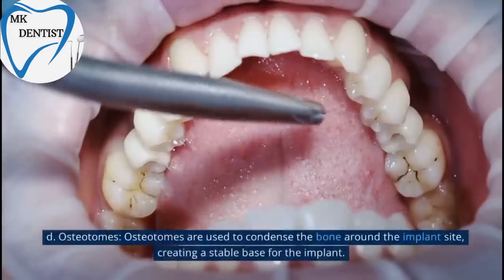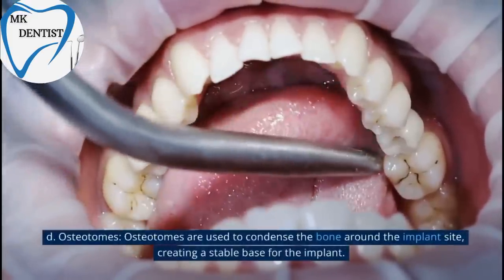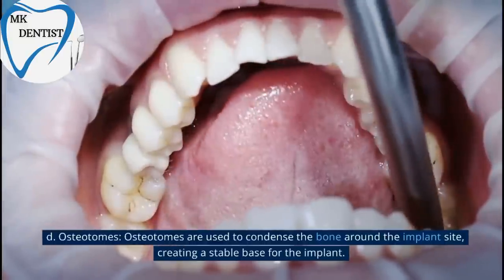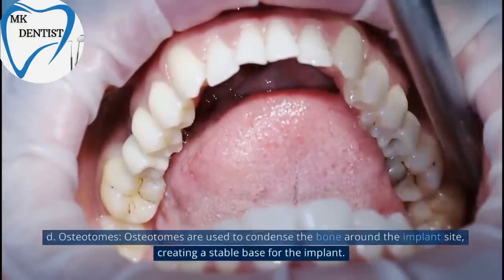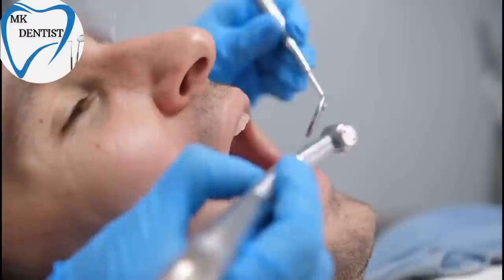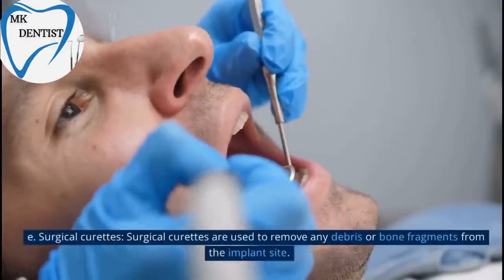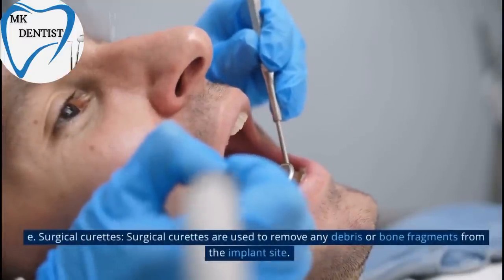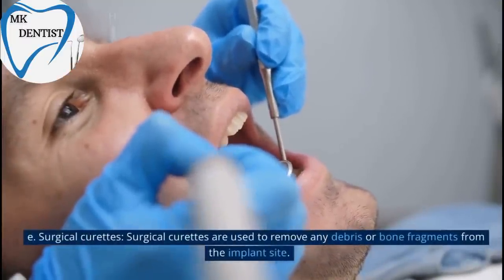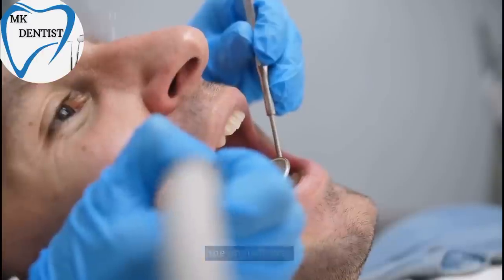D. Osteotomes. Osteotomes are used to condense the bone around the implant site, creating a stable base for the implant. E. Surgical Curettes. Surgical Curettes are used to remove any debris or bone fragments from the implant site.